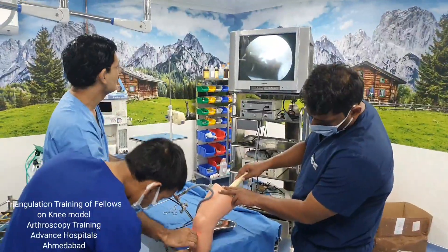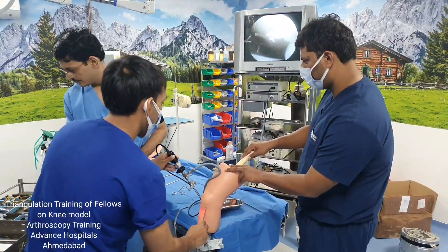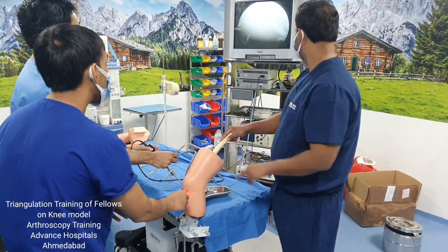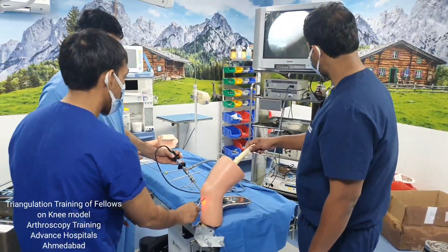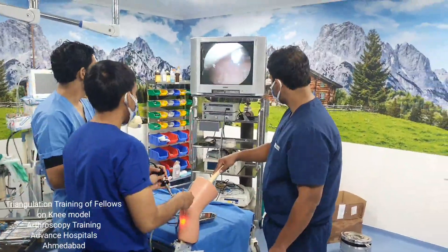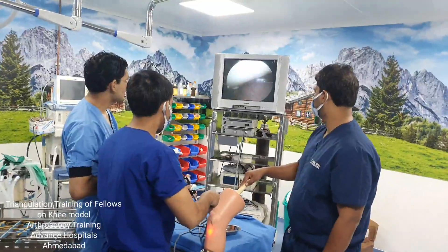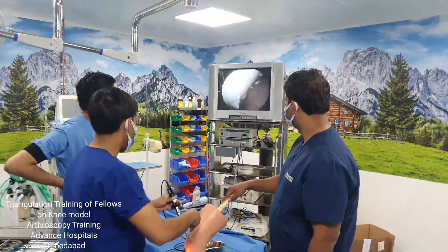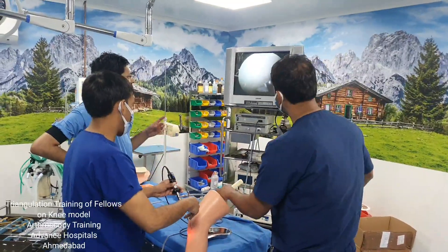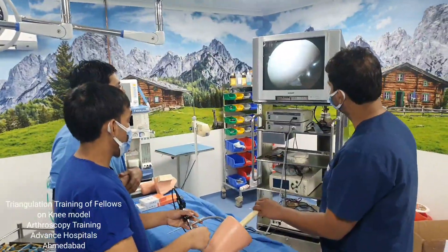You can go from here with your instrumentation. Now this is the view you should aim to see, and you have to coordinate with your probe — this is the triangulation that you want to learn. Your probe should be in the vision of your scope and you should be able to move your probe, feel the cartilage and structures with it. Triangulation means your scope, your eyes, your right hand, and your left hand should all focus on exactly the same thing.